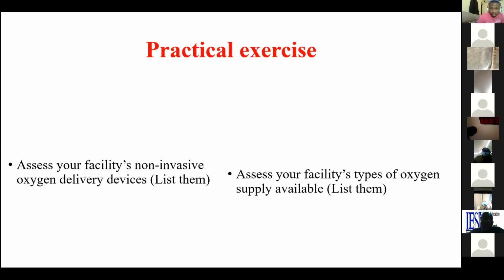If you give someone a small device, if they require a lot, it's uncomfortable and you're not helping a lot. Of course, don't take a small person and then give oxygen using huge materials. You could compare it to feeding a neonate with a big spoon. Please, I know we can list what we have.